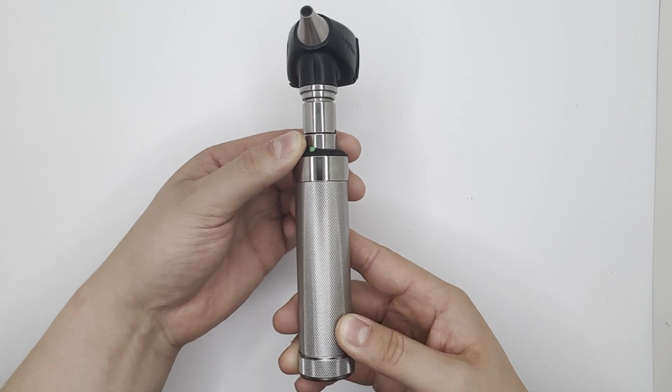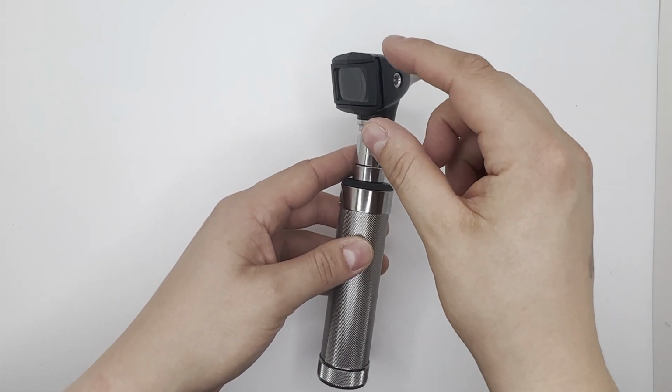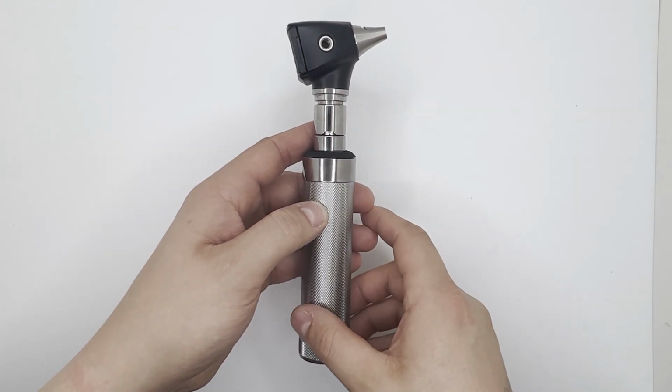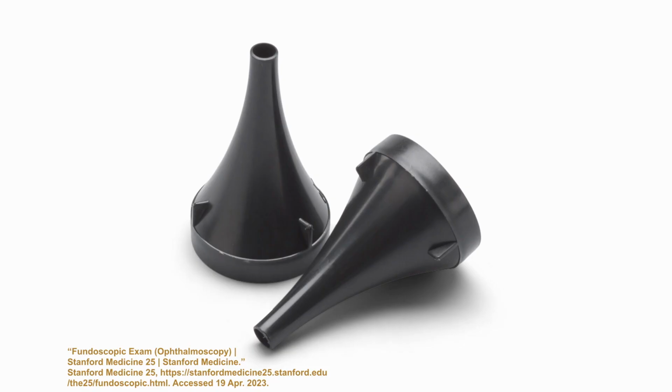Both scope heads have a low magnifying lens, which aids the clinician in seeing small structures within the ears and small details within the eyes. Mounted on the otoscope head is an attachment for ear specula, the conical tips that probe the ear canal. Specula can either be disposable or reusable.